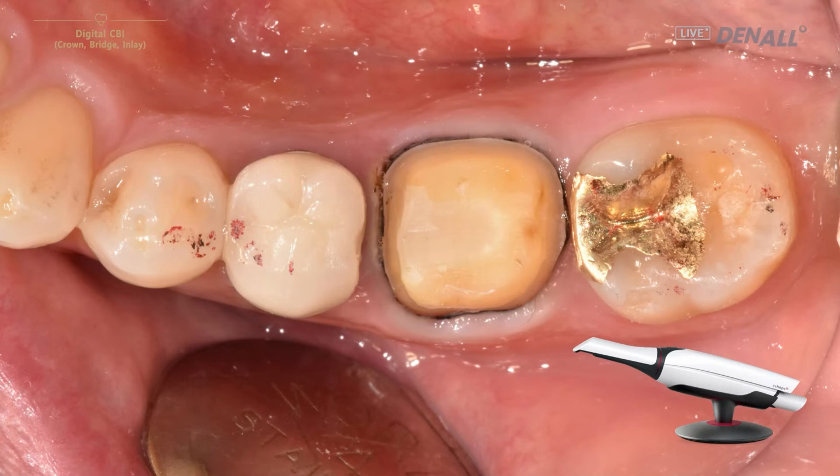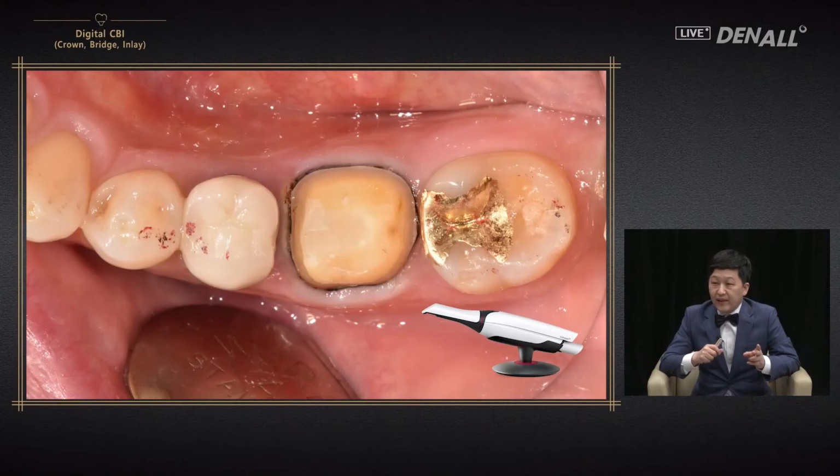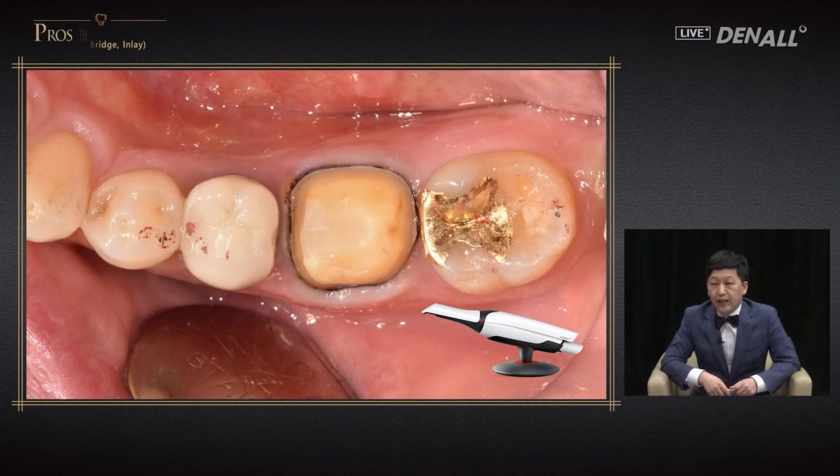In the past, in analog days, we used 1-0 and used a second cord, and after removing it very quickly, you would scan it. In digital technology, you rarely put in 2 cords, you just use one. If it is slightly insufficient, you finish off using laser. You either use 1 cord or don't use it at all to do scanning. Scanning is done.